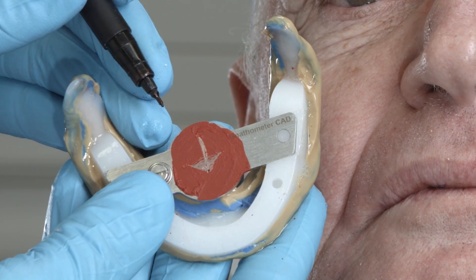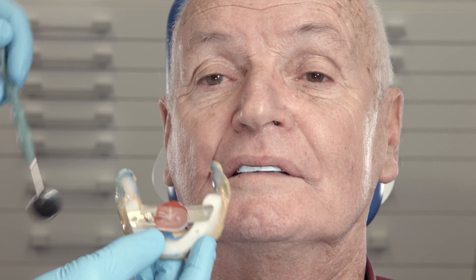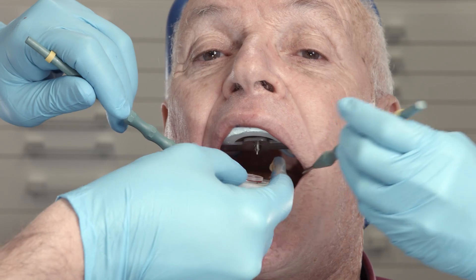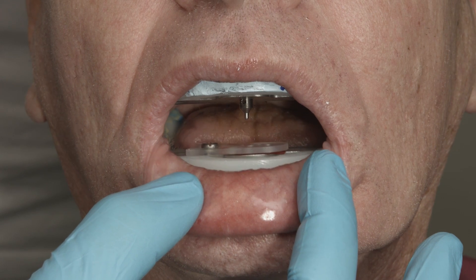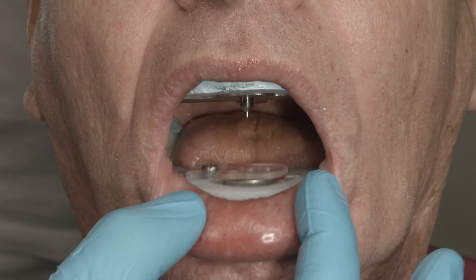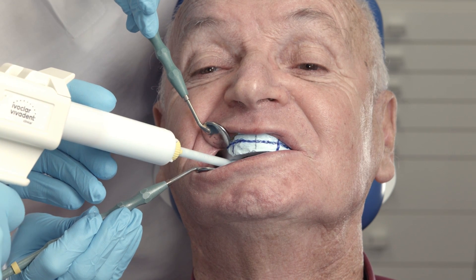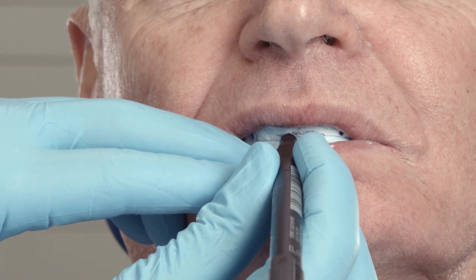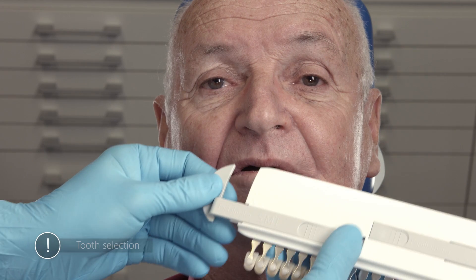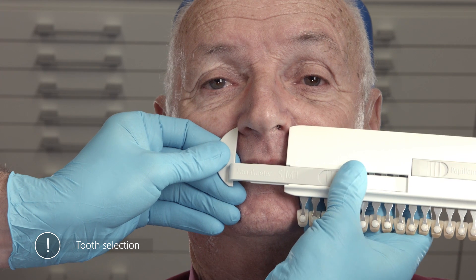Mark the tip of the arrow with a permanent marker and record the position with a perforated plexiglass block. In order to verify this position, the patient should be asked to find the centric position by themselves several times in a row. Subsequently, the situation is recorded with Virtual CAD Bite. Now you can mark the lip length. The facial meter is used to determine the width of the nose. This information provides a reference for the size of the teeth.